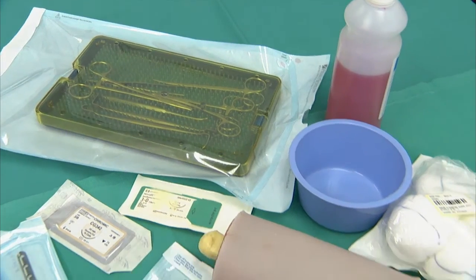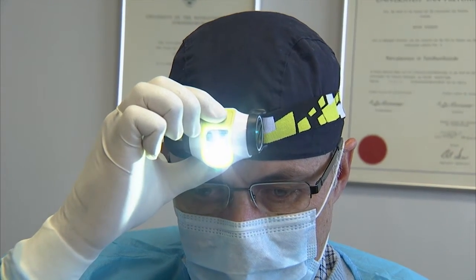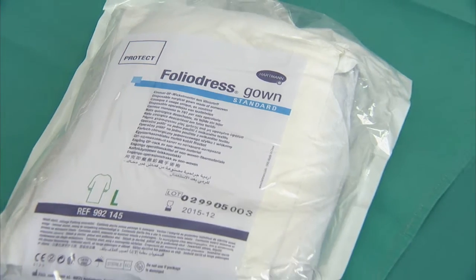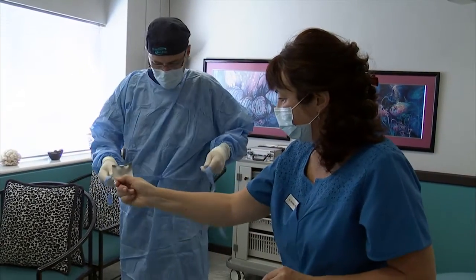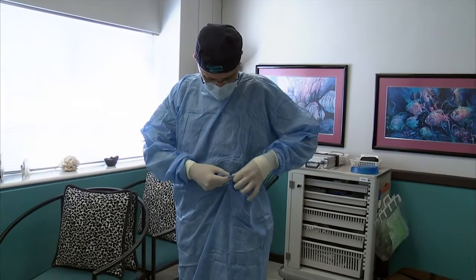The following items are optional in a simulation environment: a headlamp, a set of scrubs, a scrubs cap, sterile OT gown, wound dressing. You will also need a suitable surgical assistant to assist you. Do not perform the simulation procedure on your own as a single operator.